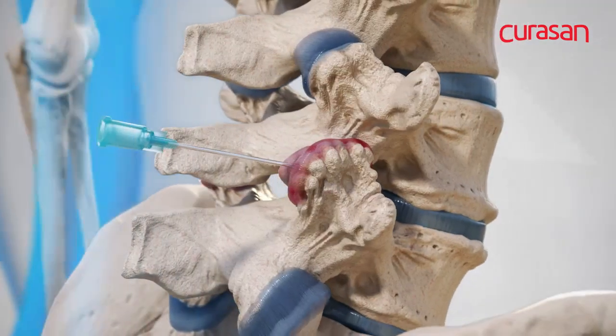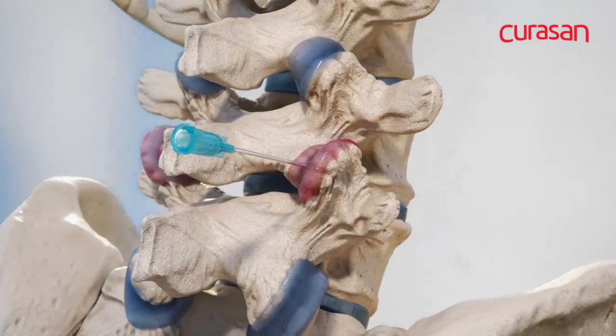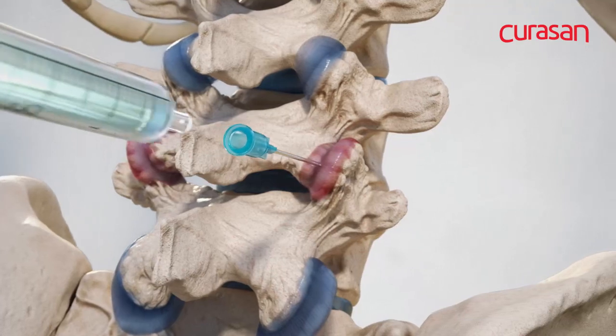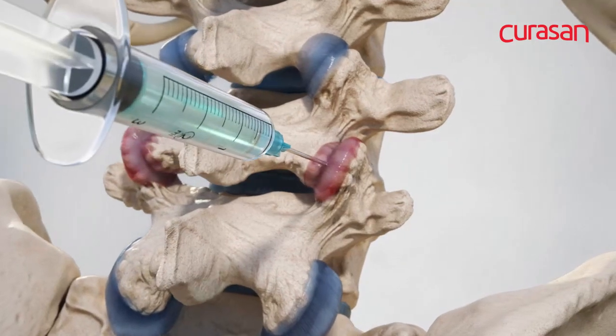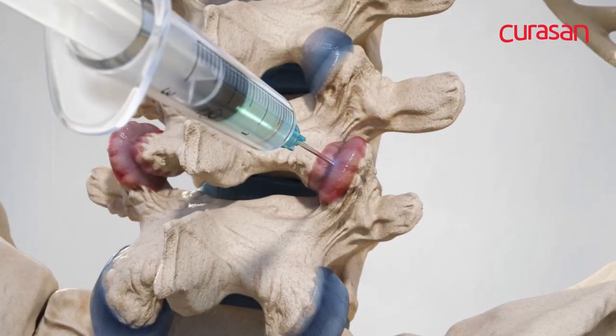After confirmation of the needle positioning, a mixture of anaesthetics and anti-inflammatory drugs is slowly injected into the facet joints.